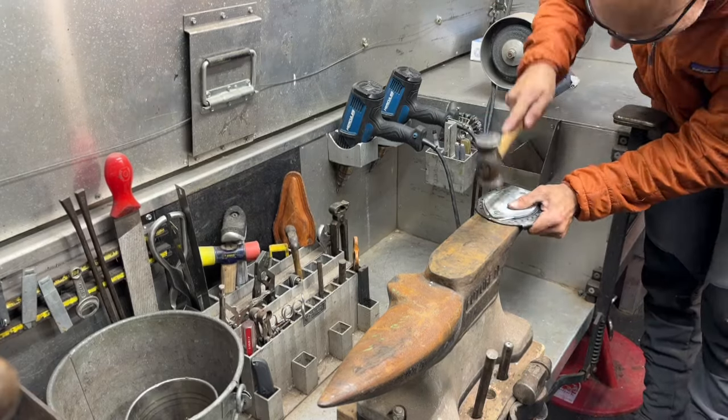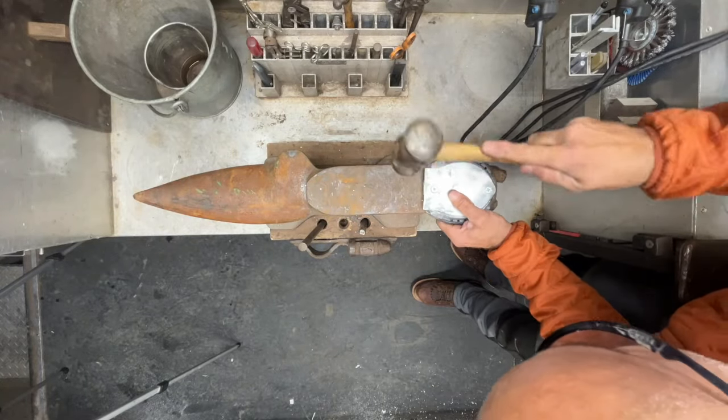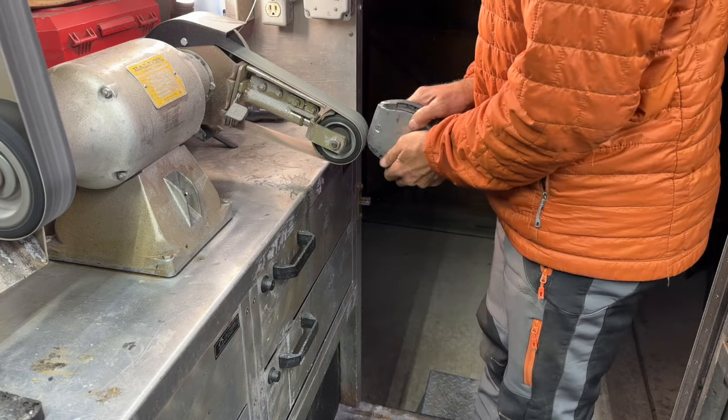Next, we're going to roll the toe of the plate so that it can match the break over the shoe. I'm also going to roll the back of my plate by the heels so that the landing is slightly softened. Fine-tune the plate and get rid of any sharp edges.